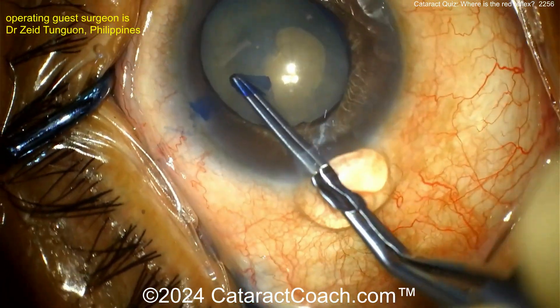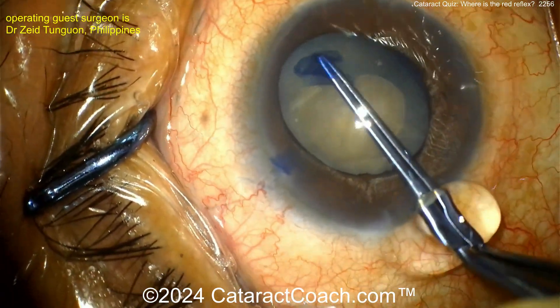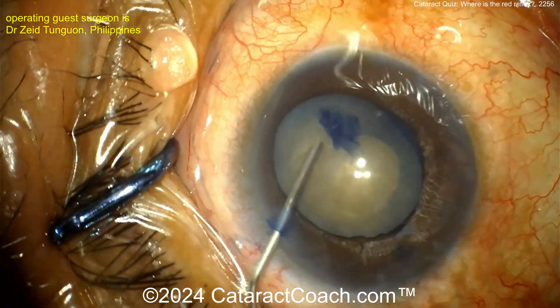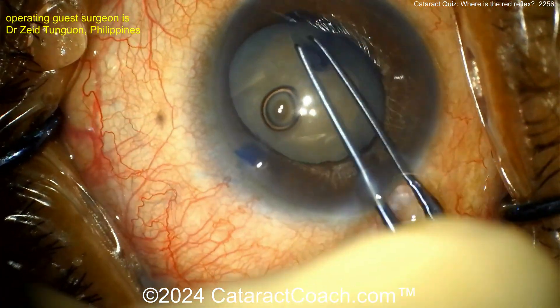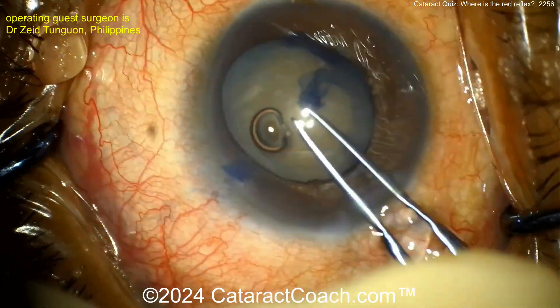What can happen, especially in a traumatic cataract, is the trypan blue dye can go into the vitreous cavity and you'll lose your red reflex. That becomes a challenge, especially if it sits right there in Berger's space, right in front of the anterior hyaloid base — then it becomes quite the challenge. Here the rhexis is pretty much completed and it looks pretty good.